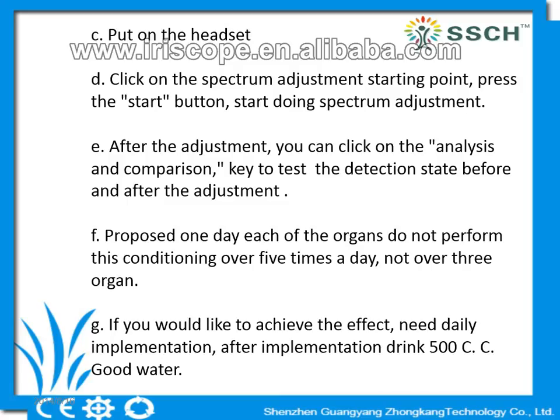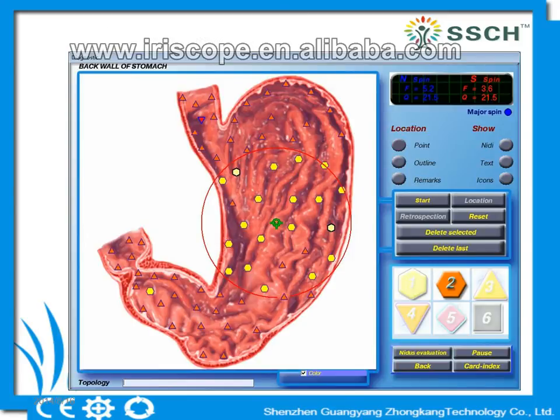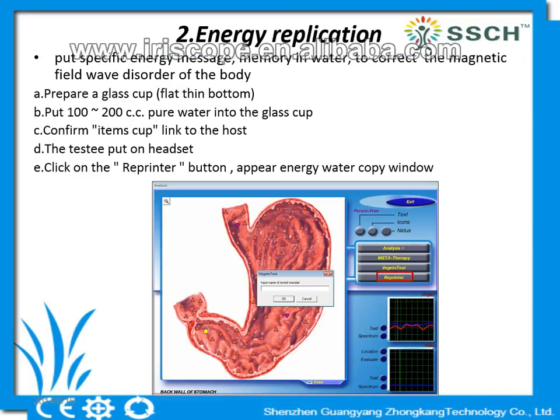The second one is energy replication. Put specific energy message memory in water to correct the magnetic field wave disorder of the body. First, you should prepare a glass cup and put 100 to 200 cc pure water into the glass cup. Then confirm the cup is linked to the host. And be sure the testee puts on the headset.